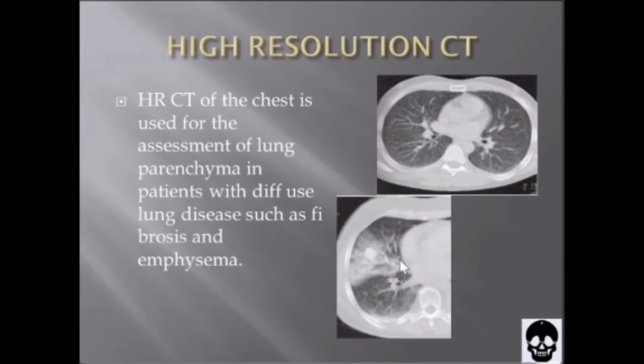Okay, this is an example of a conventional scan of a pulmonary lesion surrounded by a zone of edema or an infiltrate. This is the pulmonary lesion.